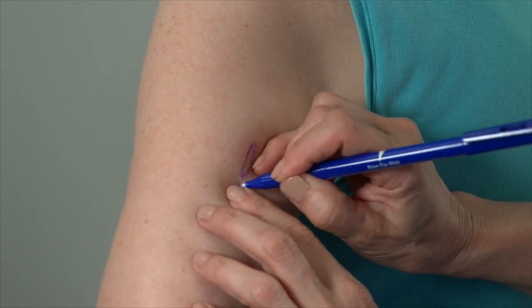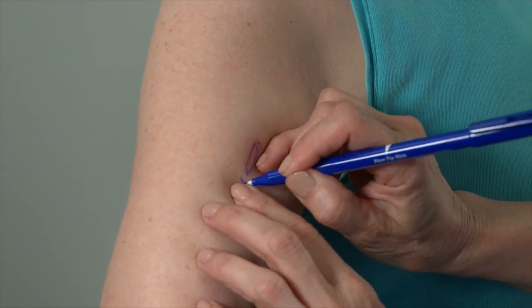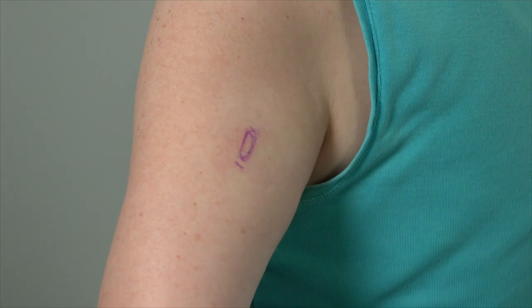Mark the planned incision line. If the sensor's distal end is within 3 millimeters of the original incision line, consider using the same line for the removal. But if the original incision line isn't visible or is more than 3 millimeters away from the sensor's distal end, mark a new incision line for the removal. This would be 1 to 2 millimeters below the sensor's distal end.